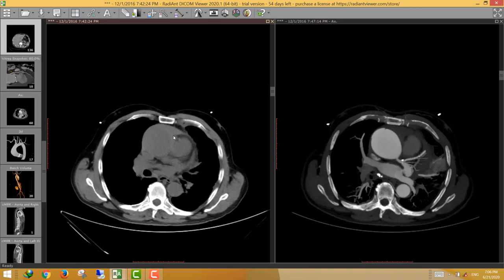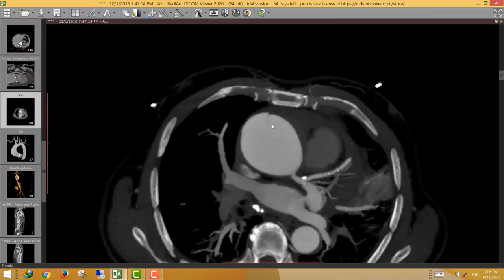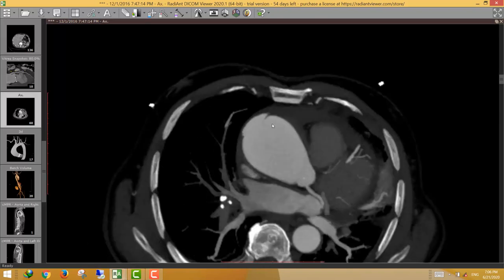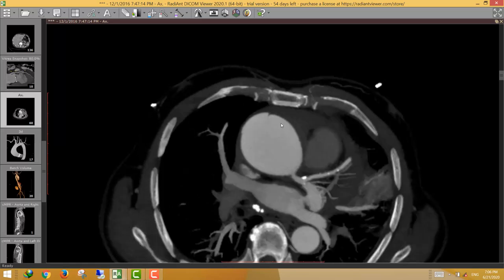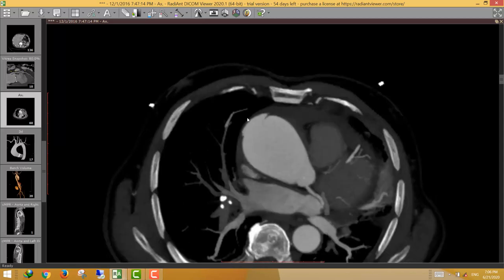The second prognostic factor is the thickness of the intramural hematoma — greater thickness carries worse prognosis. Also, associated aneurysmal dilatation, as in this case, worsens prognosis. Another very important finding is an ulcer-like projection: a contrast-filled outpouching extending beyond the aortic wall along the anterolateral wall of the ascending aorta.